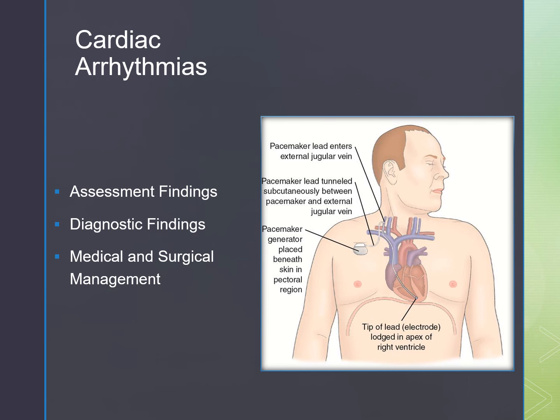An automatic implanted cardioverter defibrillator is something that's implanted like a pacemaker, and whenever it senses these shockable rhythms, it will cause it to shock the client. We can also use the patches or the pads or the paddles that we physically apply to the client's chest and defibrillate that way.